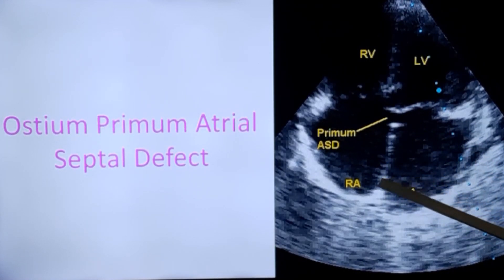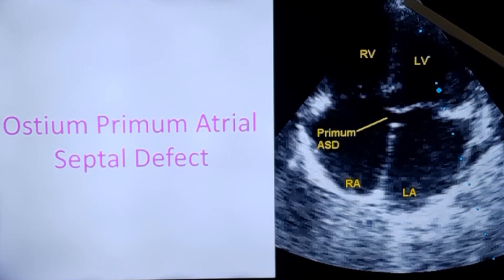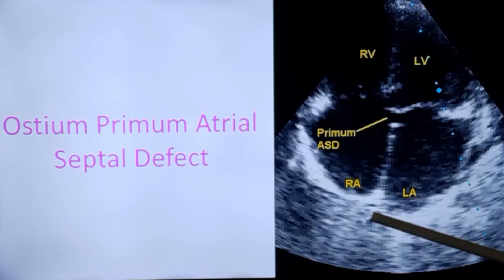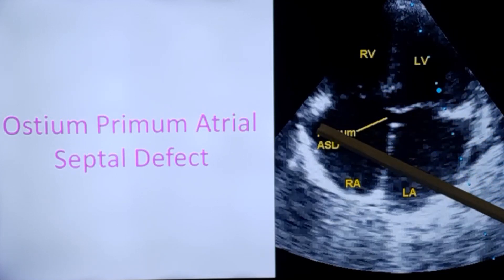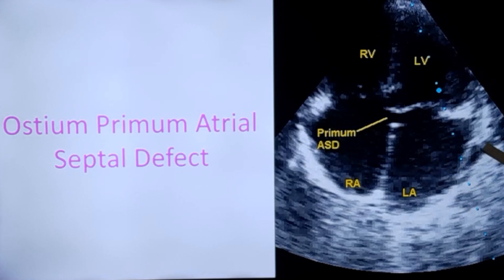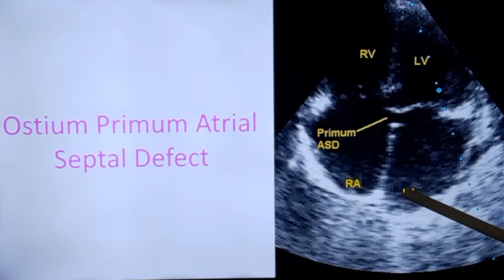Left atrium, right atrium, left ventricle, right ventricle. This is from the apical four-chamber view — the transducer is at the apex of the heart and you can see all four chambers as in a textbook description. Here you can see these translucencies are the pulmonary veins draining into the left atrium. Usually you can see only three pulmonary veins in most echocardiographic views.